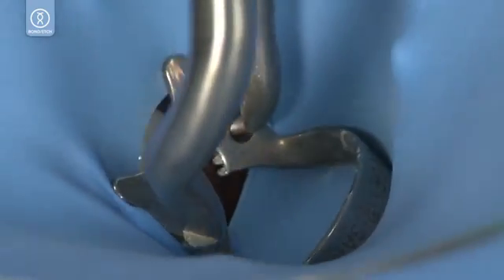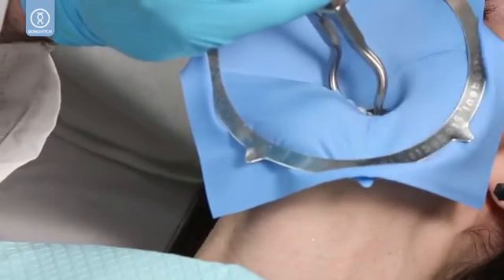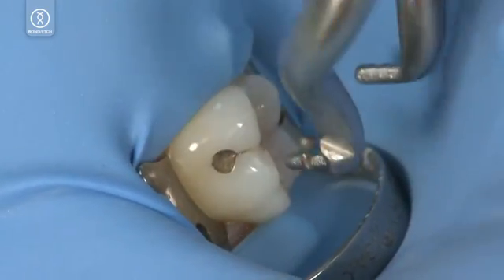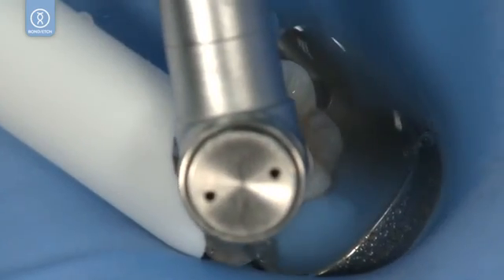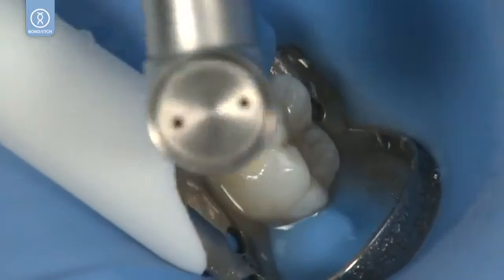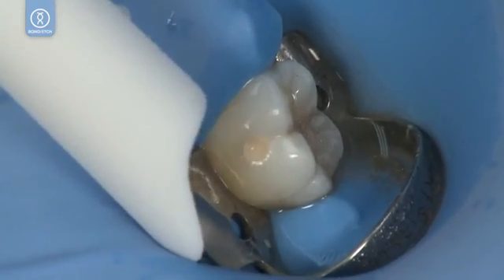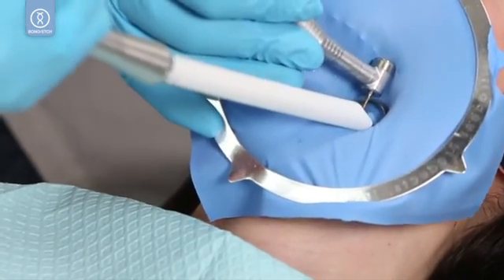Isolate teeth using Dermadam and Dermaframe Rubber Dam Frame. Remove amalgam with a carbide burr, then refine the prep with a diamond burr.